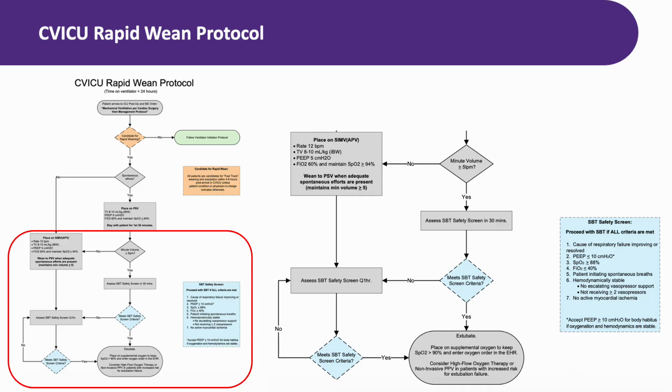The common thread through all of them is screen, trial, document, and communicate. Follow the algorithms, use your clinical judgment at the decision points. Document everything and coordinate with the care team. Thank you for your time and commitment to our patients. If you have questions, reach out to your leadership or the ICU Liberation work groups. We're all in this together.